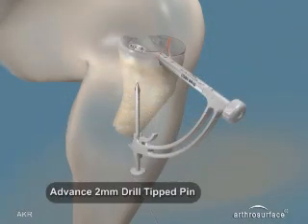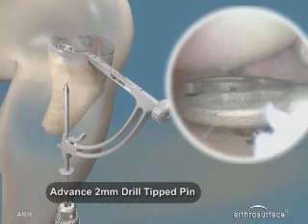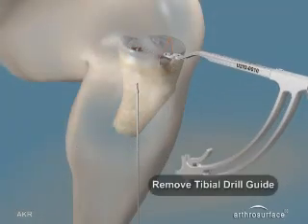Align the guide arm anterior-posterior and insert the 2 mm drill tip guide pin through the bullet and exit at the center of the tibial template. Remove the bullet and the tibial guide.